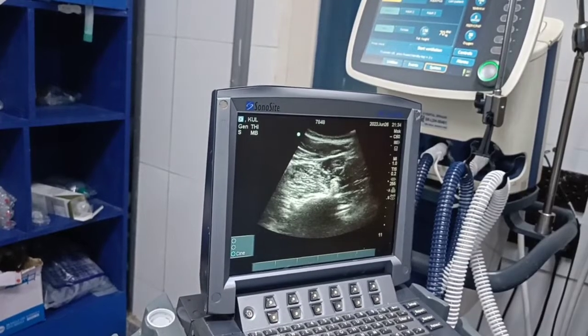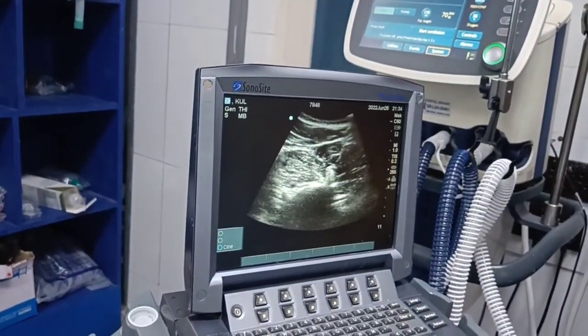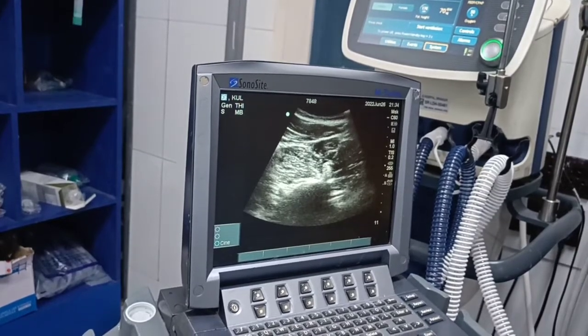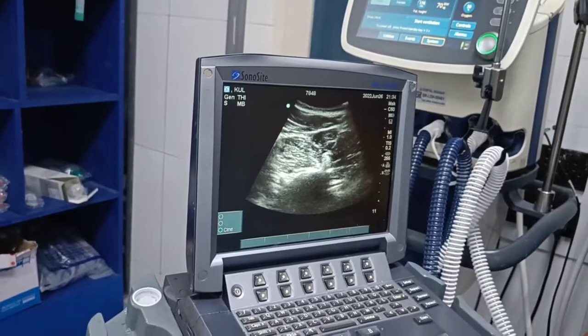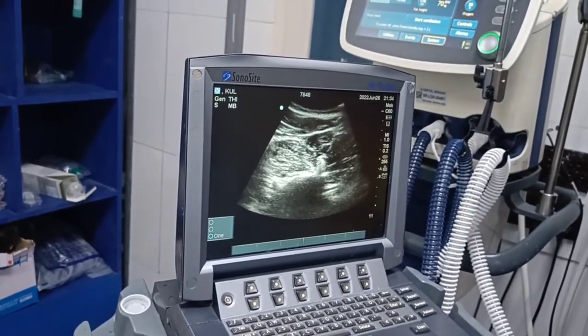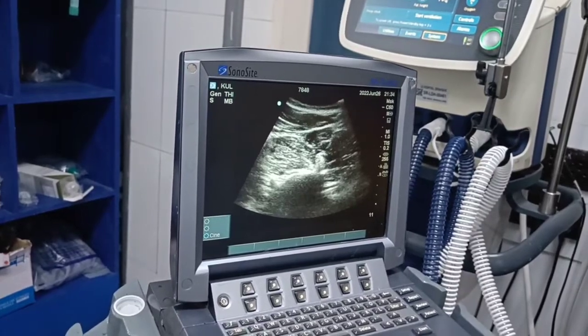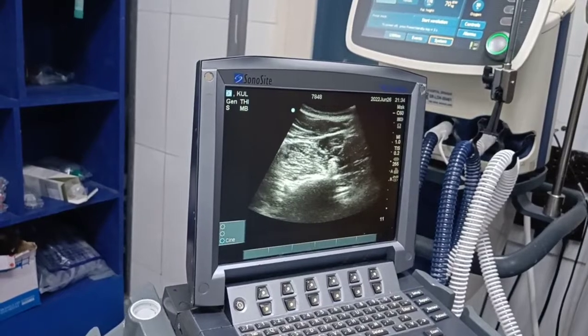Usually you use a nerve stimulator also. Once you get there, there will be a contraction of the quadriceps muscle, and then you know that you are on a lumbar root, mostly L3 or L4. Then you inject around 20-30 ml of drug. But it's also a vascular area, so you have to be careful while you inject the drug. This is the Shamrock method.